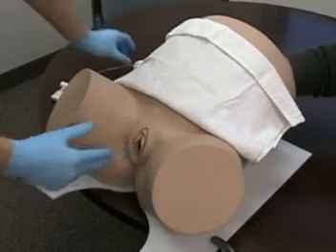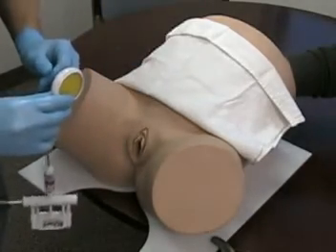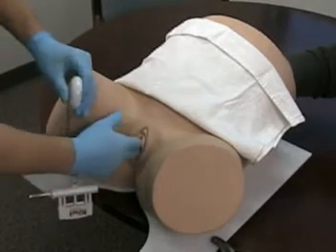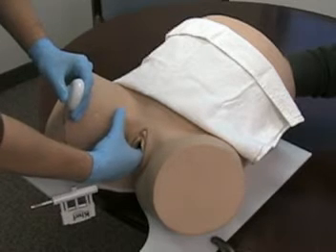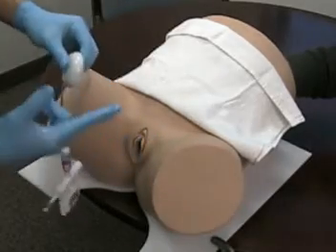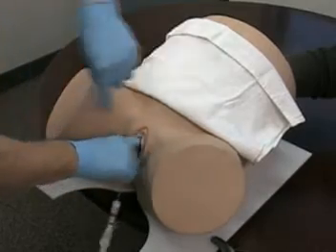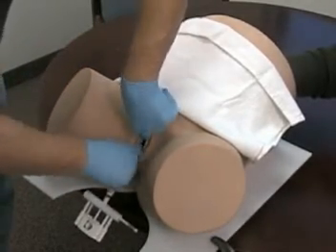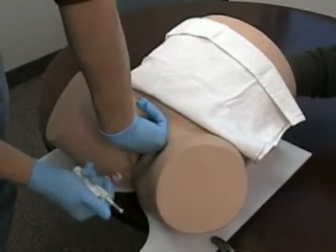The second step is to place the vacuum device over the flexion point. Recall, the flexion point is 3 centimeters forward of the posterior fontanelle. Thus, a measurement is taken from the posterior fontanelle 3 centimeters forward. The distance is determined, and the cup is placed at that distance. 2 fingers are used to place the cup back over towards the flexion point, and then vacuum is obtained.